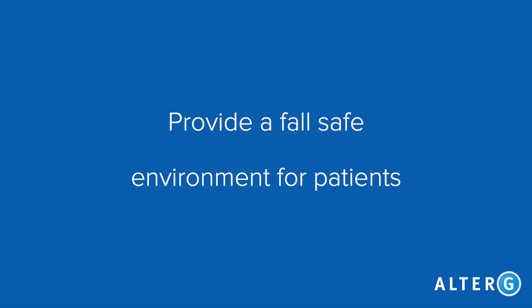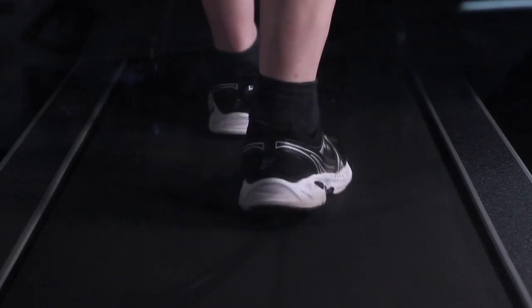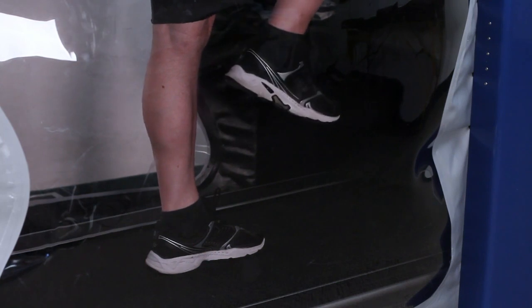The second goal is to provide a fall-safe environment for neuromuscular re-education and challenges. Some examples of this are correcting scissoring gait by using visual cues from our video monitoring system, practicing single limb stance activities to improve static and dynamic balance, and working on gait kinematics.